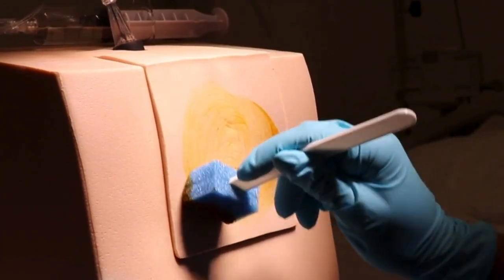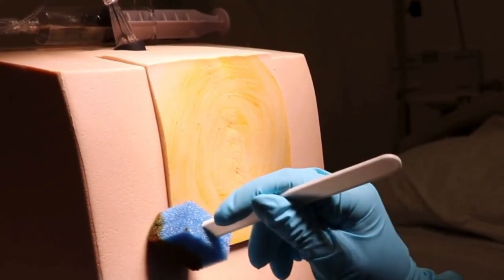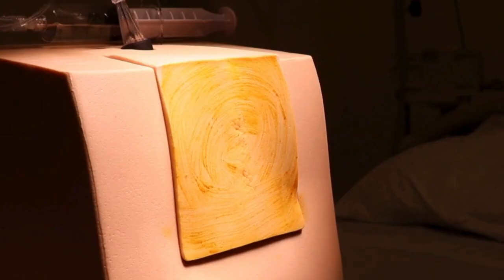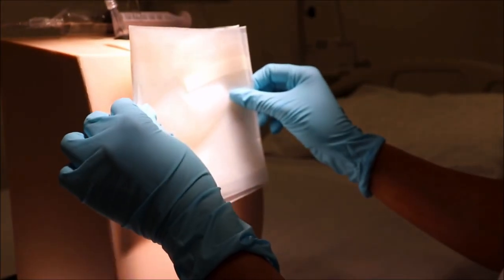Hold the prep stick tipped downward to prevent dripping onto your arm, and clean in a circular motion starting from the center and moving outward. Allow the prep to dry completely before placing the sterile plastic drape on the patient's back, taking care not to contaminate it. At this point, instruct the patient not to move or touch their back.